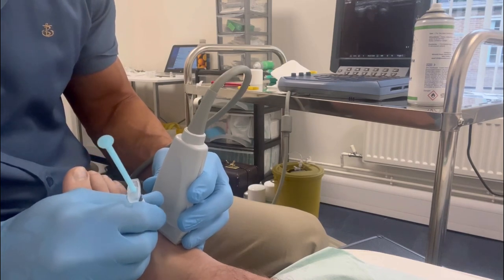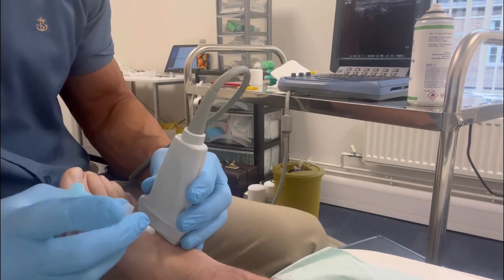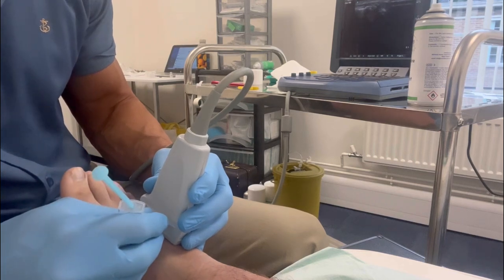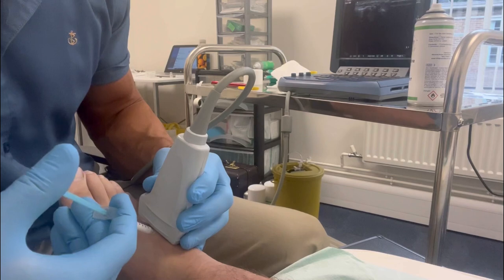Here we're doing a corticosteroid injection with some lidocaine with a 29-gauge needle, which makes it almost pain-free to perform. The injection is quick and usually takes less than 10 seconds.